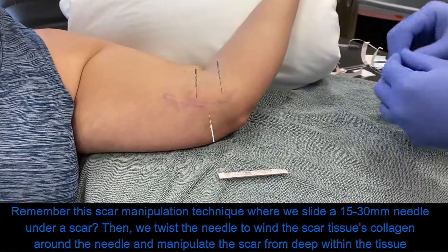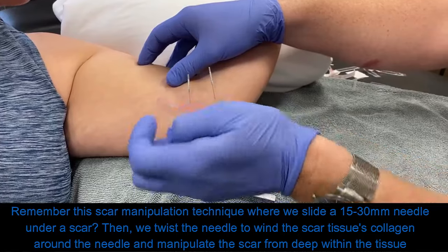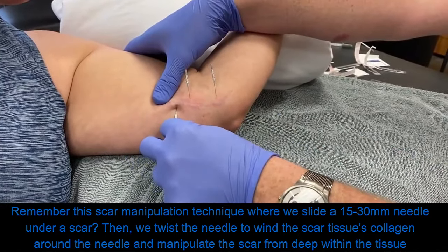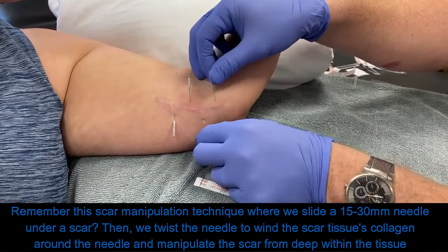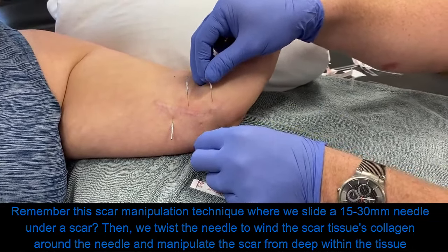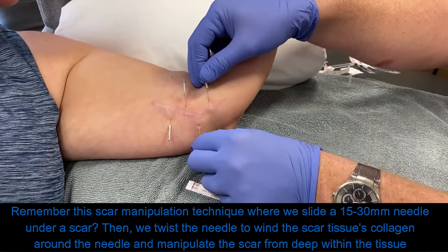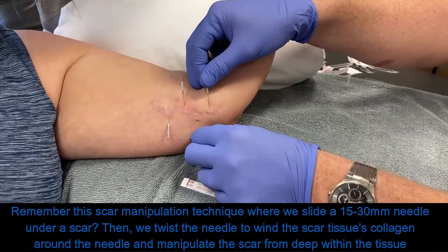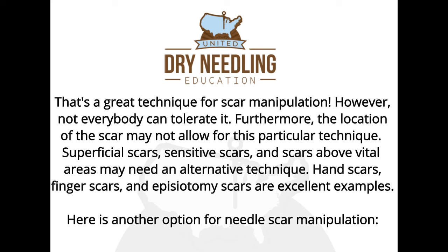I should have stabilized the skin right here - that would have let the needle go in a little bit easier, but I was trying to stay out of the way of the camera. Just tap the needle in with a superficial technique. I did stabilize the skin so the needle slides directly underneath the scar a little bit better. Now the fun starts - a little collagen winding. If there was volume attached to this video, you would have heard that sweet student scream. I think she said she felt like her soul was leaving her body at that very moment.